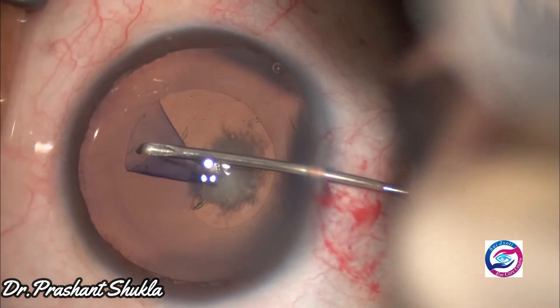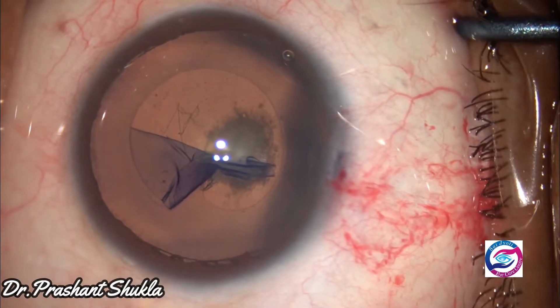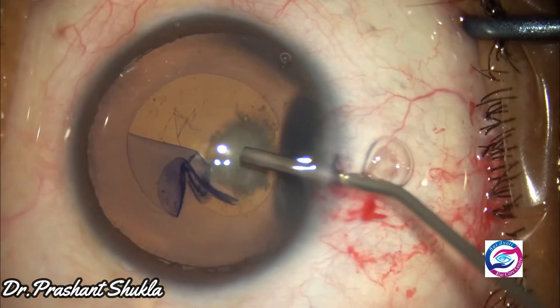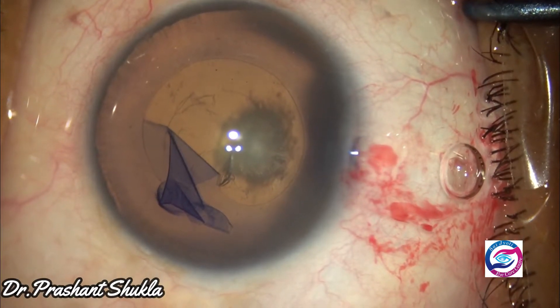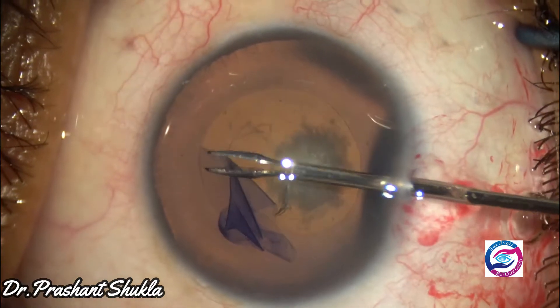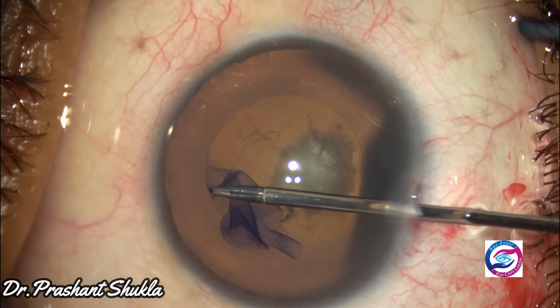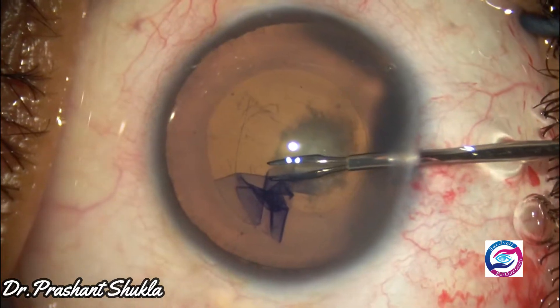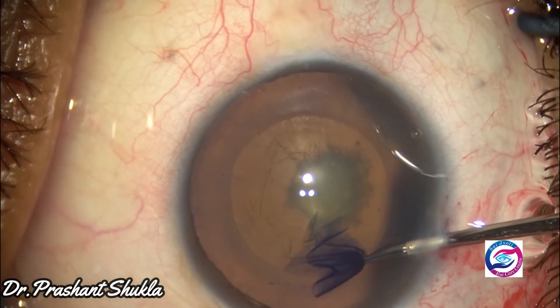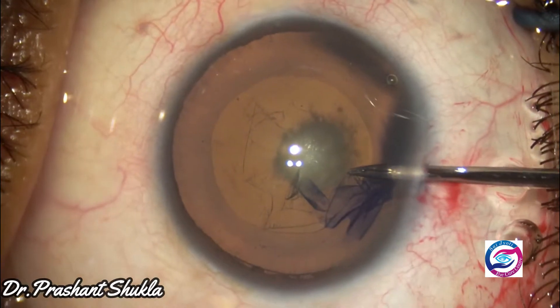I am aiming for a capsulorrhexis of a size of about 5.5 millimeters. Rhexis is then completed using a 23 gauge micro-rhexis forceps through the side port.